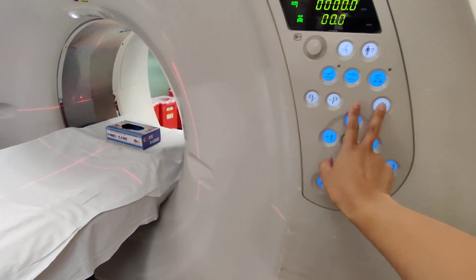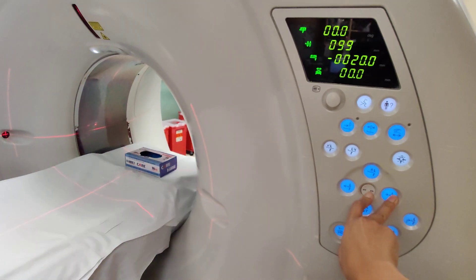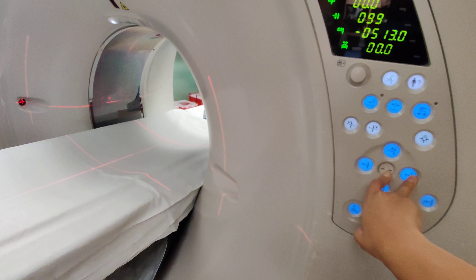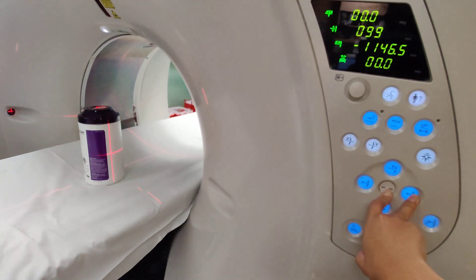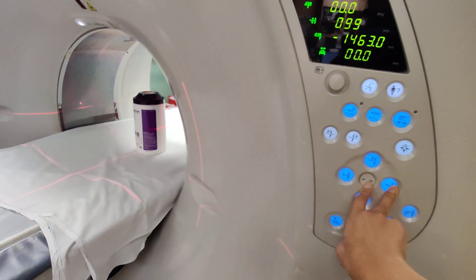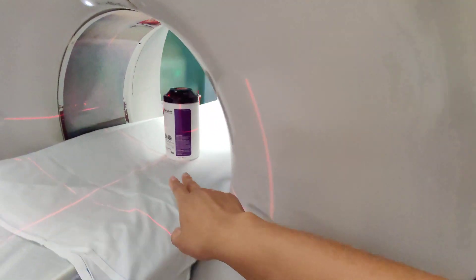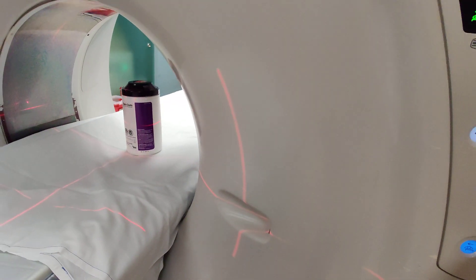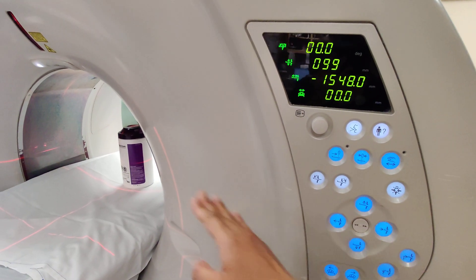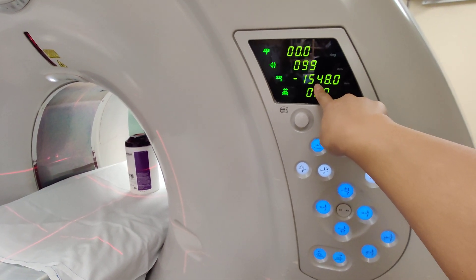So what you're going to do is turn on your light again and go all the way until that inside light reaches where your desired position is going to be. So that's the top of the chest — that's where you want it to be. Right there, top of the chest. So you know in your machine you're going to have this much.